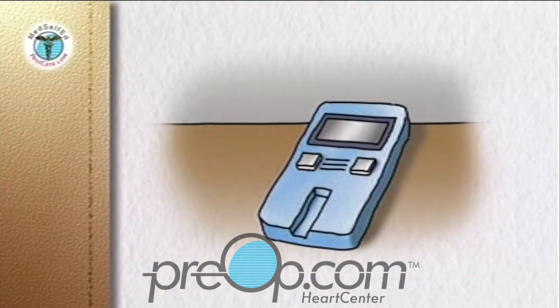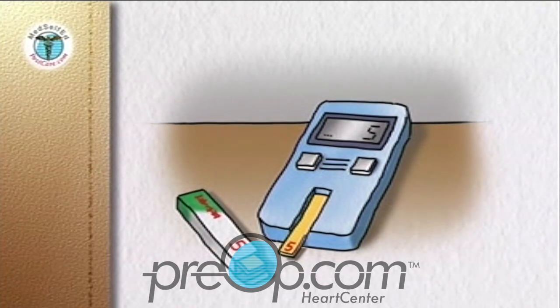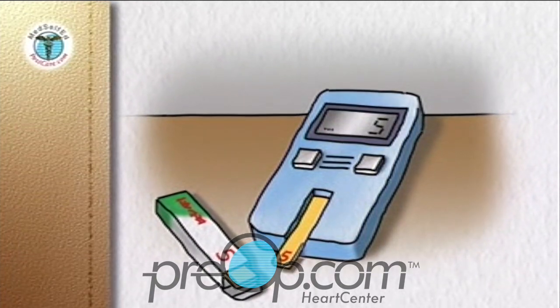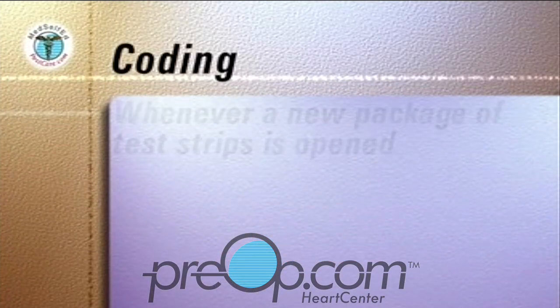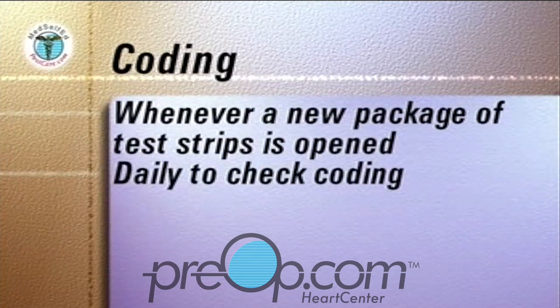The first step is to code the meter to match or calibrate the meter to the reactivity of the test strip. This is done by following the manufacturer's instructions and matching a number on the meter's display to a number on the code strip or on the test strip package. Coding is done whenever a new package of test strips is open, and daily to ensure the meter is coded correctly.